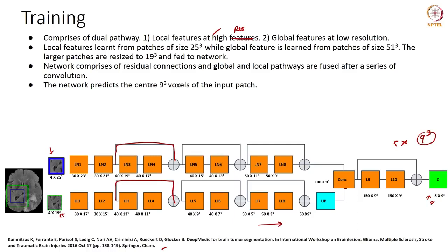And so, this particular architecture incorporates both those concepts that I mentioned earlier, and also, instead of trying to predict the entire image in one pass, you are trying to predict only smaller cubes, of course smaller volumes. But then you do have to raster through the network in order to obtain the full result.